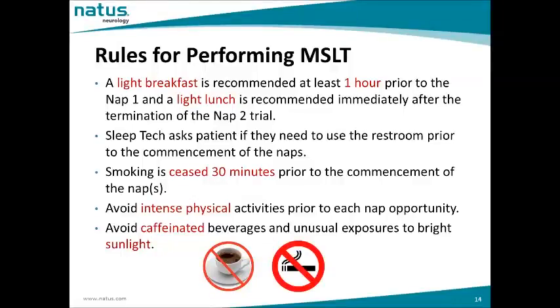So a light breakfast is recommended at least 1 hour prior to nap 1, and a light lunch is recommended immediately after the termination of nap 2 trial. The sleep tech should ask the patient if they need to use the restroom prior to the commencement of the naps. Smoking is ceased 30 minutes prior to the commencement of the naps, and the patient is advised to avoid intense physical activities prior to each nap opportunity. The same applies to avoiding caffeinated beverages and unusual exposures to bright sunlight.